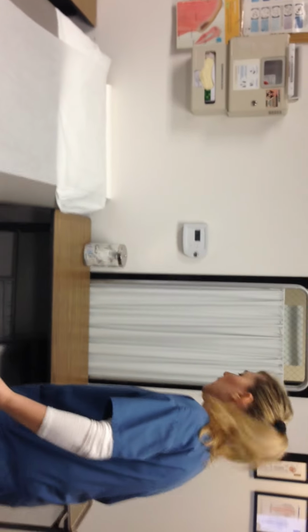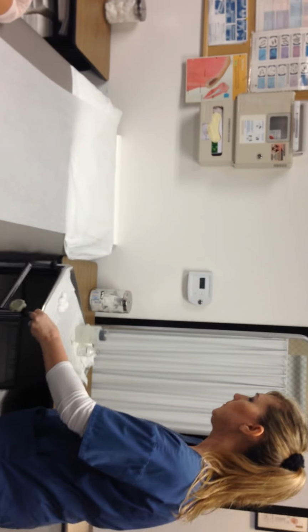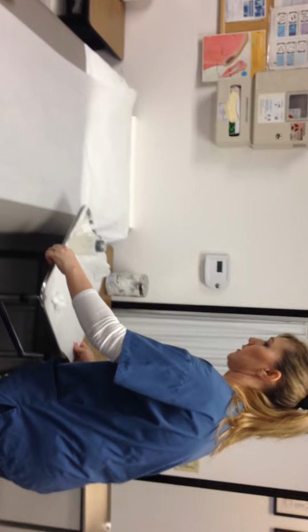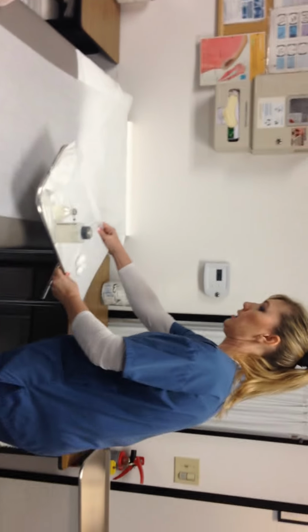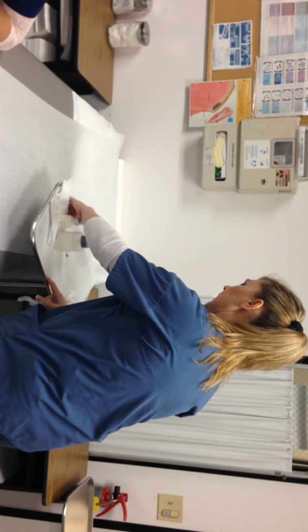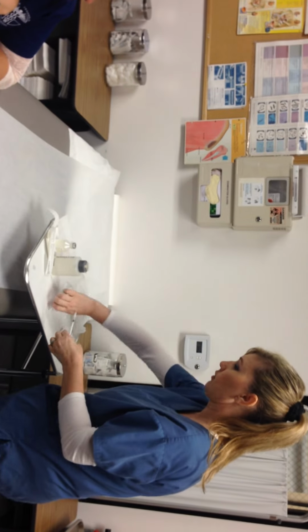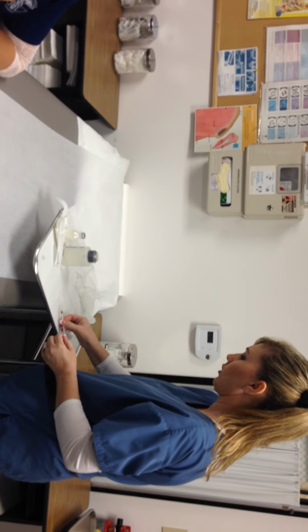Okay? Here's the other thing I need. I need my tray on my right side. Okay, I'm going to move this around a little bit. I need my tray on my right side because I'm right-handed. And we never, ever, ever, be careful with that. See how it came out of there? You got to be careful. You don't want it touching your tray.